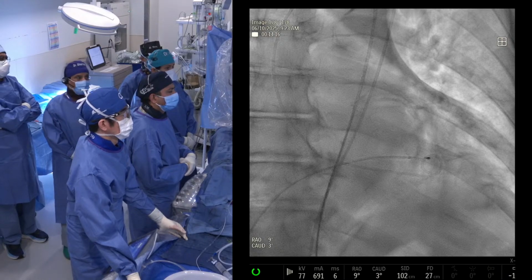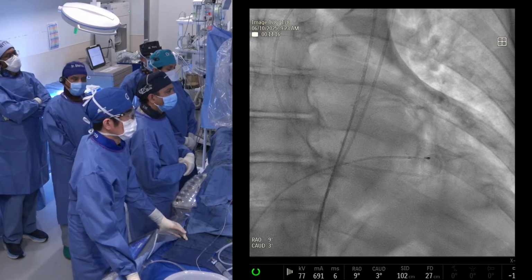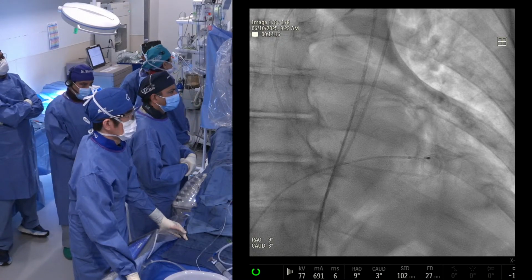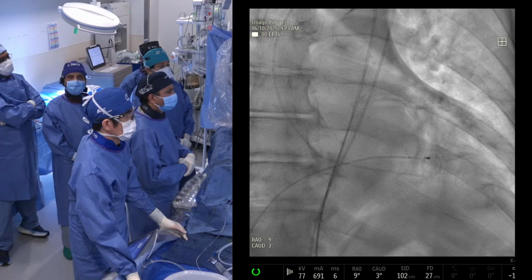Patients compliant, non-compliant, so many factors. With a high gradient, doing a BAV is quite safe, using a small balloon. You don't have to do a full one, just decrease the gradient by 30 to 40%, so the patient remains good for the next 4 to 8 weeks.